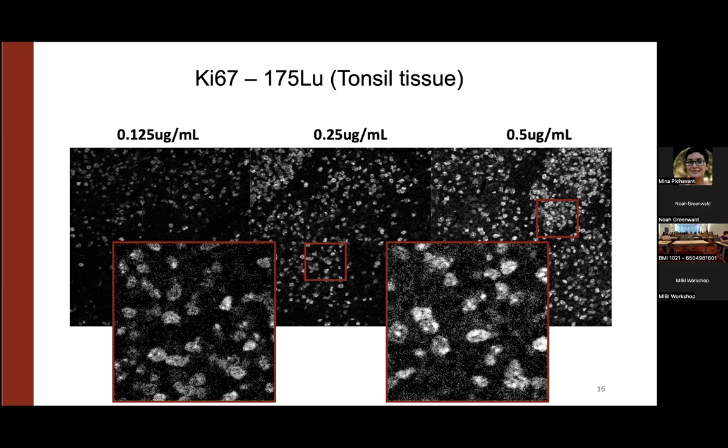Yeah, we've drilled through. It's going to depend on the titer and on how long the incubation is, but by and large, we found that if you're doing 4 micron sections and overnight incubations, you get full depth penetration. If the sections are thicker, say 50 or 100 micron sections, maybe that would change. But we've seen that it pretty much goes through the whole depth.